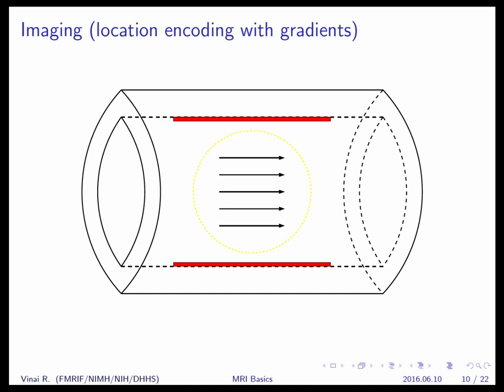And we usually have 3 sets of these. They're designed to generate fairly uniform gradients in the magnetic field, either along the x-axis, along the y-axis, or along the z-axis. Or in your case, if you're accustomed to thinking in patient coordinates, uniform fields in right-left, AP, or superior-inferior. Okay. So what happens is when you turn the currents on, here we're looking in Y, up and down right now, so this will be AP in your patient.